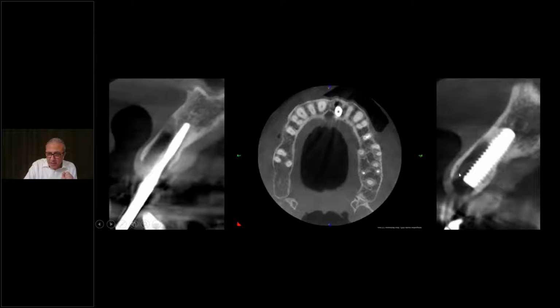This is the implant placed, leaving the gap, subcrestally sinking the implant, leaving the buccal gap. This is the way we do it. This is not arbitrary placement. So my advice to you is: do not think it is easy to just put the implant in with your hand manually and think you are an expert. I have been 30 years in this profession, and I fail to put an implant in, to do the drilling this way. I have to use the surgical guide.